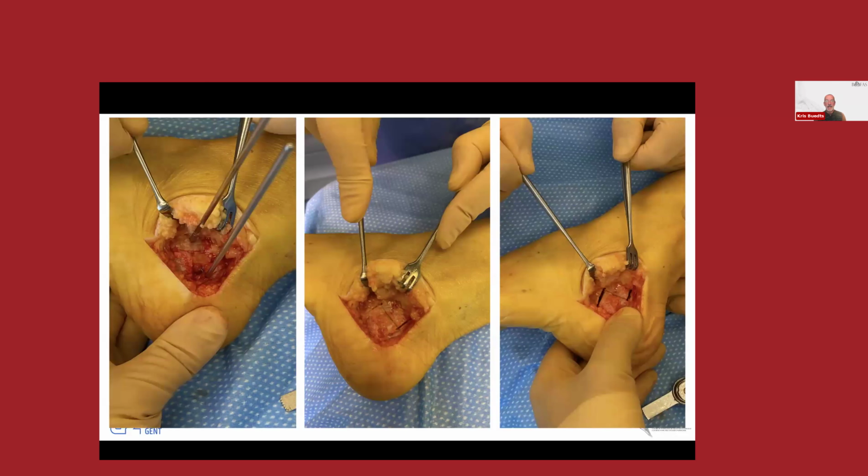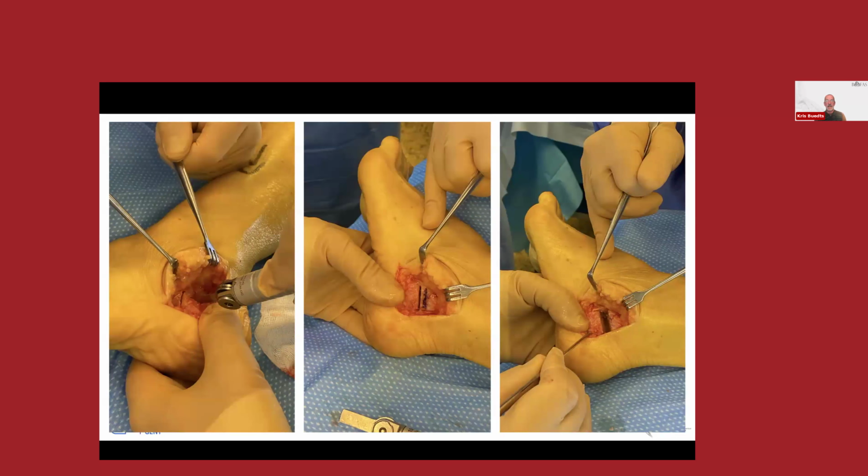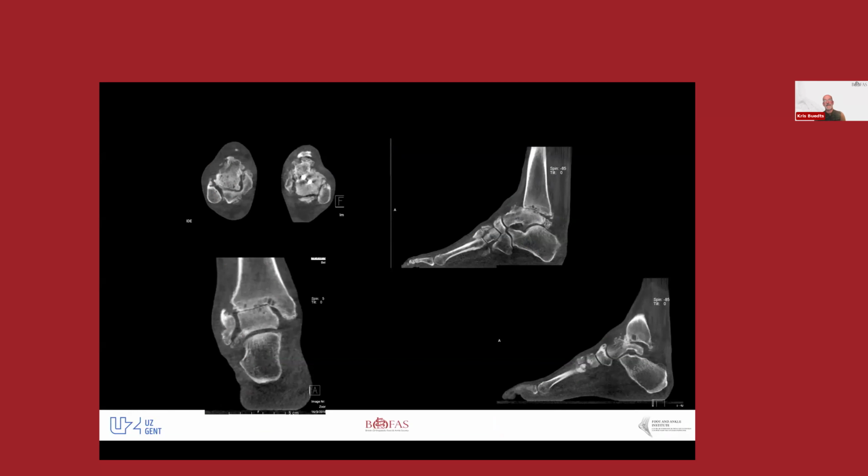So this is our Malherbe osteotomy. It's quite an easy osteotomy. You don't need a big incision, and you take a wedge out. With this wedge, you can reduce the hindfoot position, and you fix it with one screw, which is enough. This is a case before we had Prophecy, so it's done with an external guide. It's a professional football player.